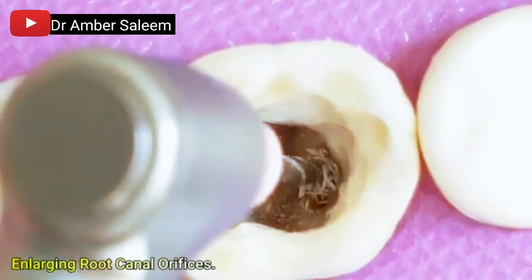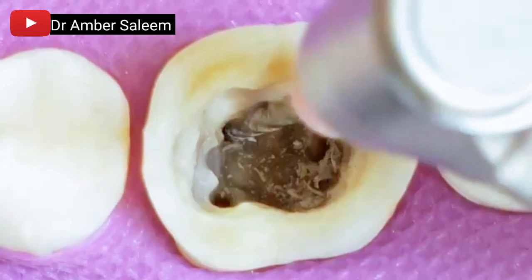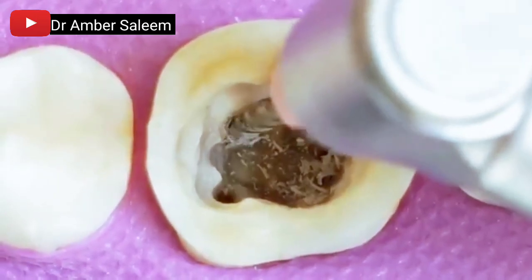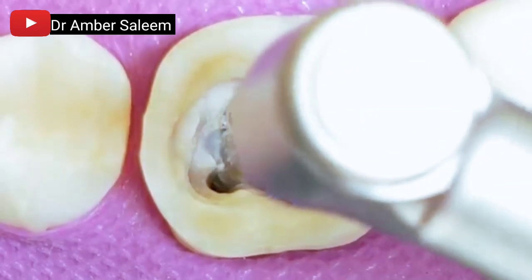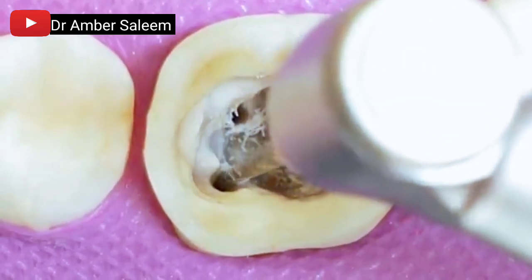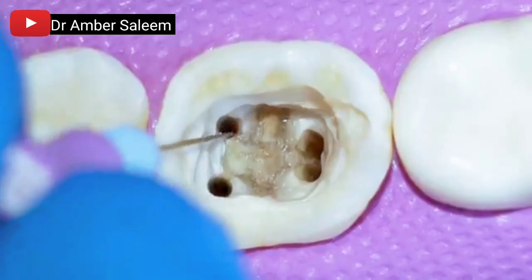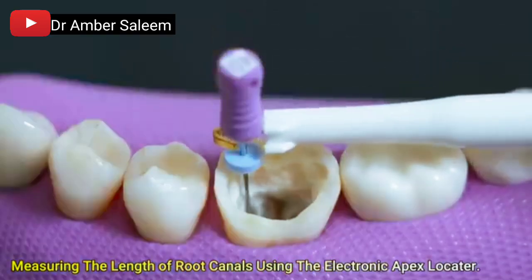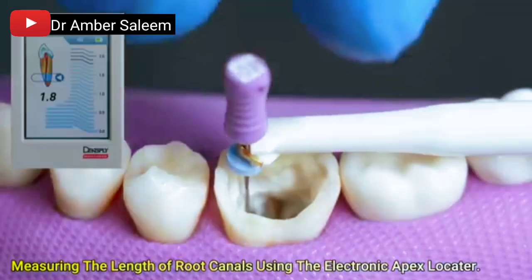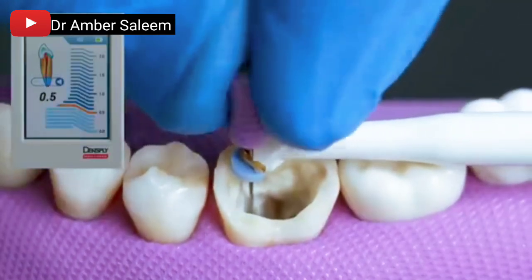Enlarging the root canal orifice. Measuring the length of each root canal using the electronic apex locator to determine accurate working length for instrumentation.